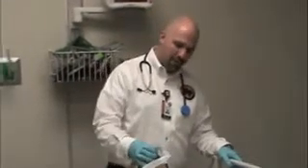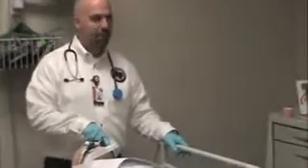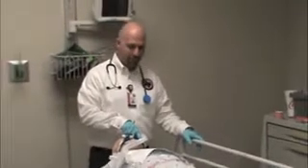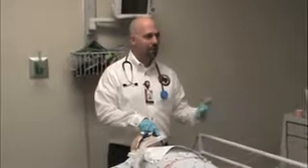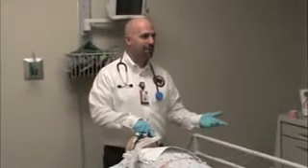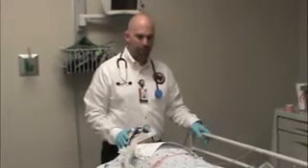You want to always be aware of the depth of the ET tube at their teeth. So you want to make sure that if you started out with an ET tube at 21 centimeters at the teeth, that you arrive at the receiving hospital with the same depth measurement. Most adult patients are going to have an ET tube between 21 to 23 centimeters at the teeth as an average. And if you have any doubt, you want to make sure that you have access to a chest x-ray before you walk out the door so you can see exactly where the position of the ET tube is. And the physician should feel good about showing you that.